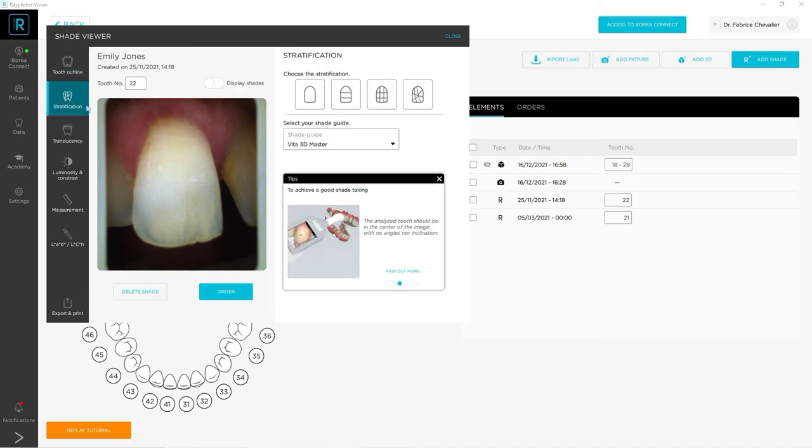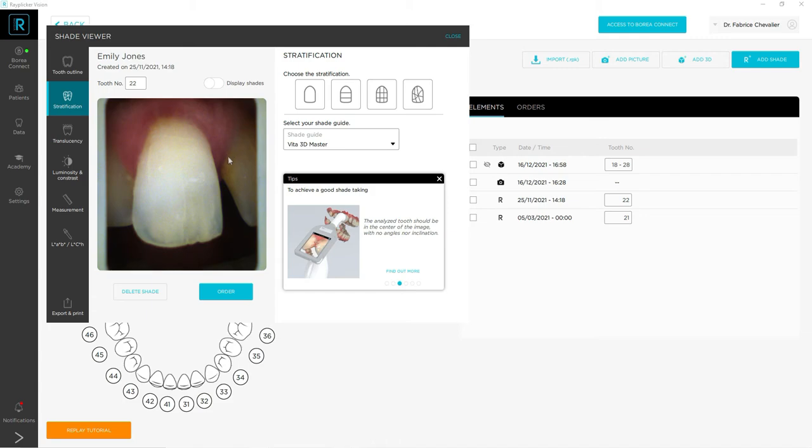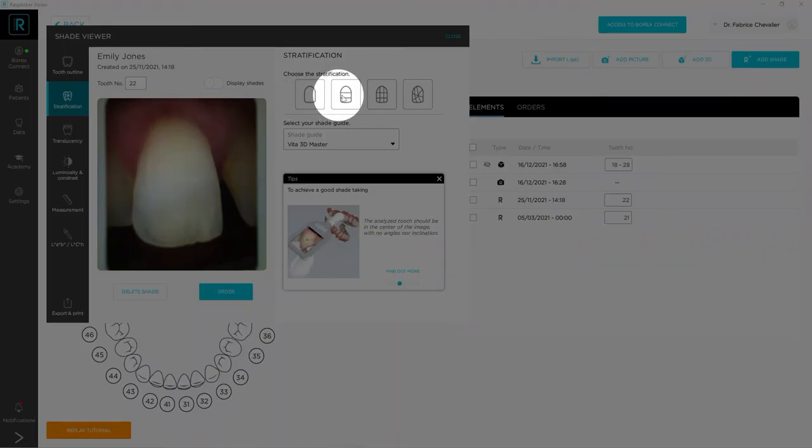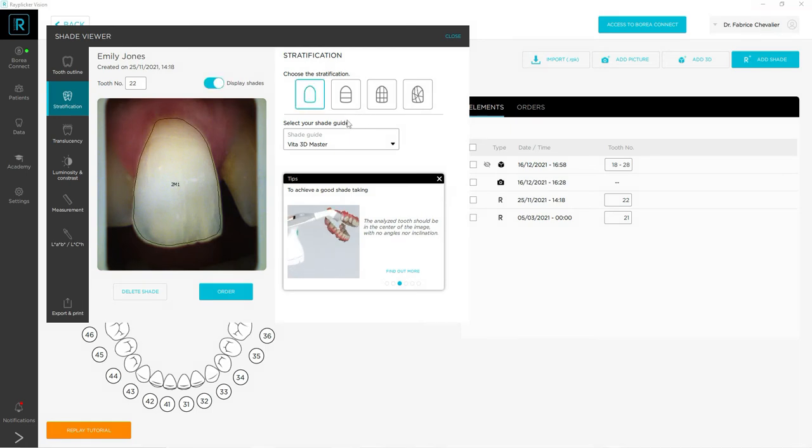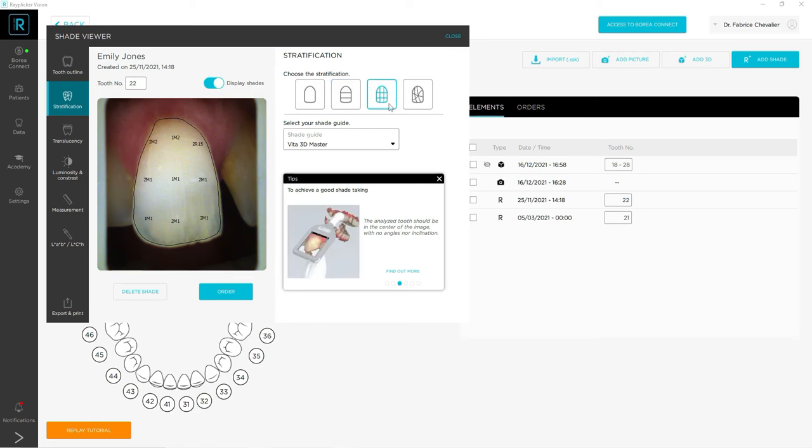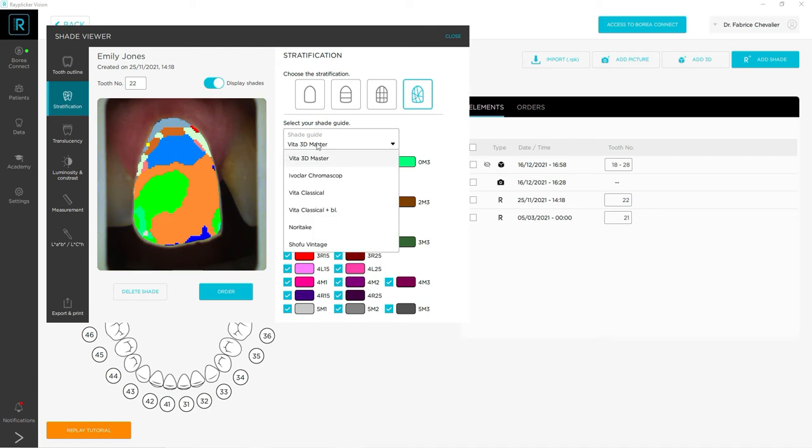The second button is the stratification one. As I said earlier, you have the polarized image. You also have on the top right some stratification icons. You can have the one zone mapping, the three zone mapping, the nine zone mapping, and the detailed one. You can also change the reference shade guide in the scrolling list.